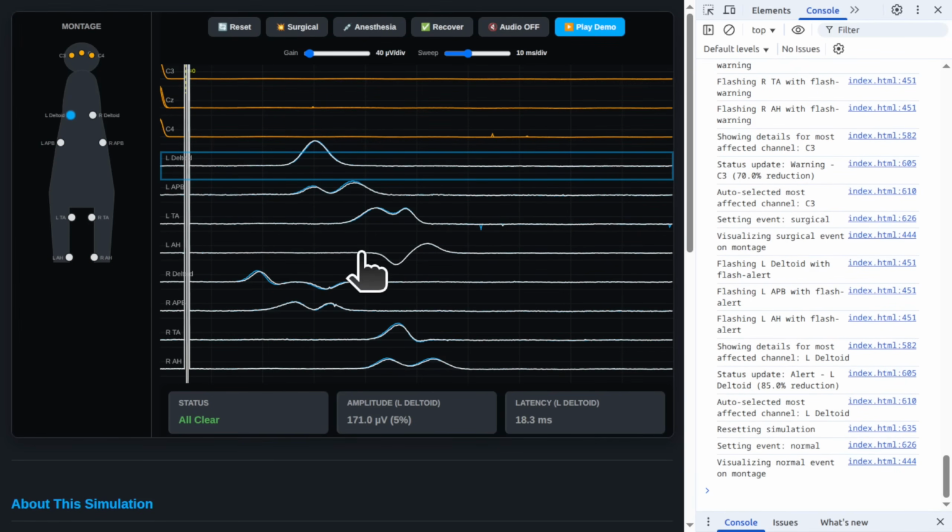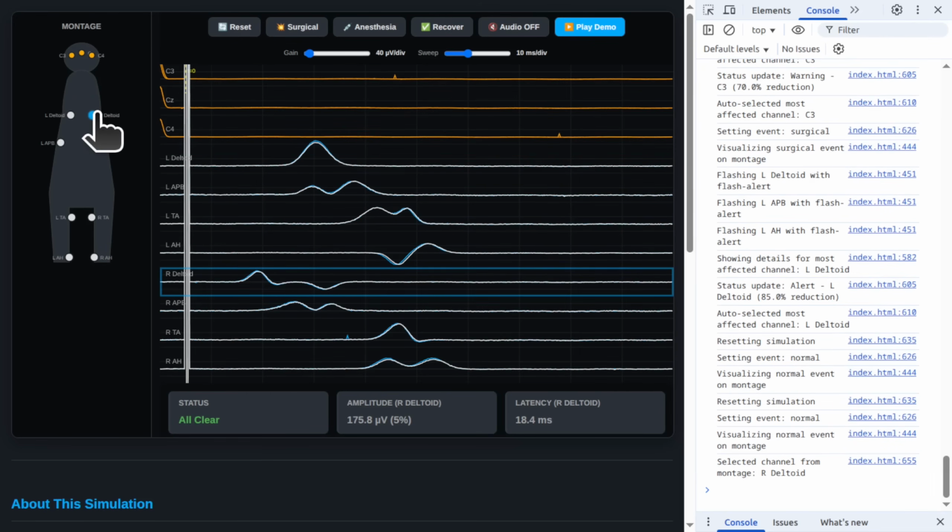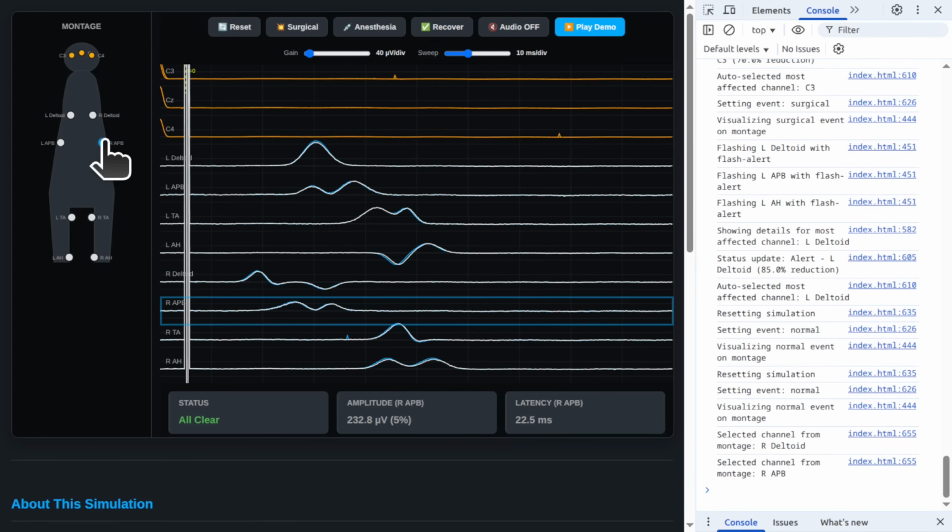And what's fascinating here is just how much detail they've built into this. It makes it feel incredibly real. It's like looking at a full dashboard of vital signs, right? With the multi-channel montage showing all the different nerve pathways being monitored at the same time. So you're seeing responses from various points, including both peripheral muscle MEPs and those cortical EEG-like responses from the brain.